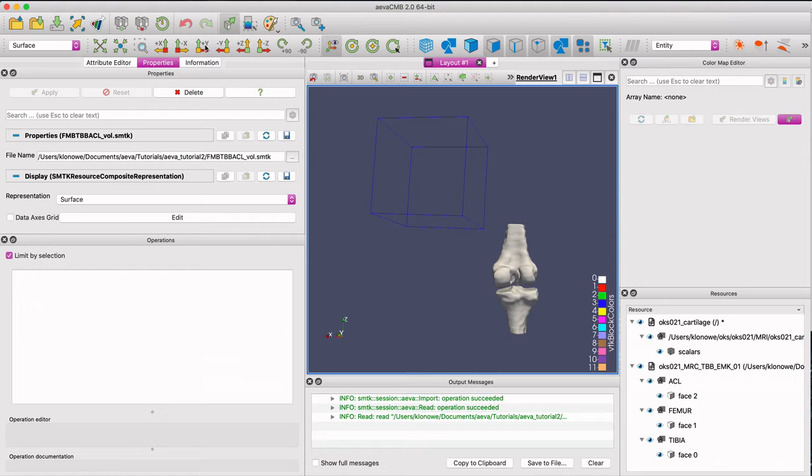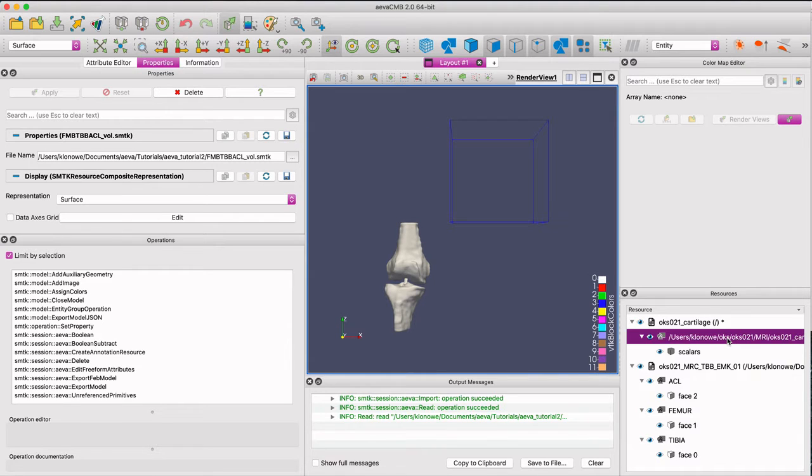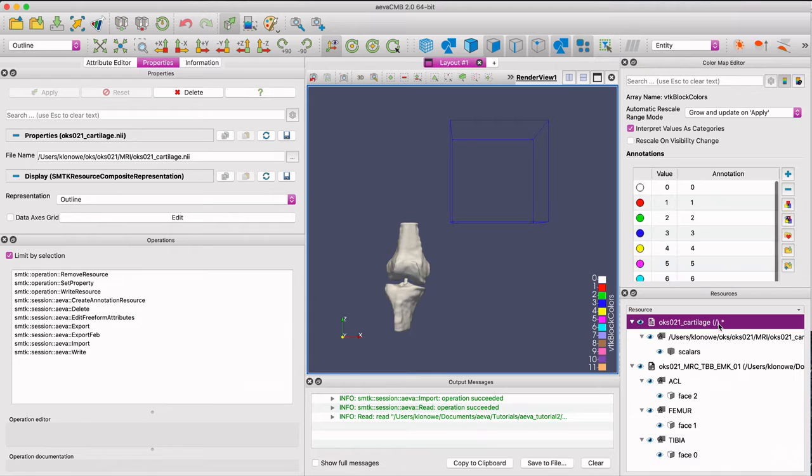Select the desired volume from the resource panel and move to the properties tab and select volume inspect.